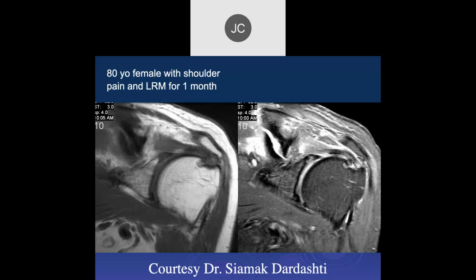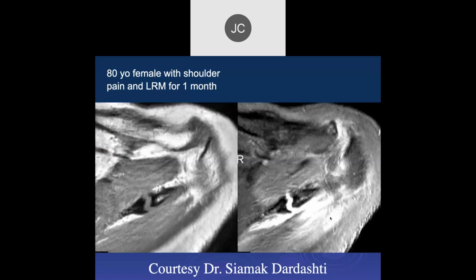Yeah. Remember, we're talking about fractures. I don't think it's just a slice. I think there's a femoral neck fracture, like right there. Or sorry, humeral neck. Yeah, or like... Well, I think we're getting out of the proximal humerus here. What about here? Mm. I'll show you another image.